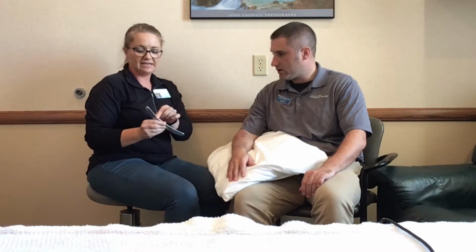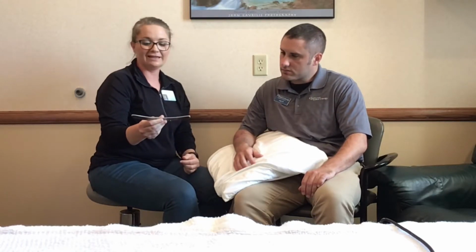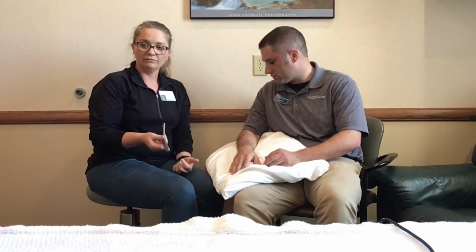And so you can see these edges are beveled. So it's not like I'm hurting them or cutting them. Some of them look like knives, but they're nice and smooth. So we're just rubbing that area to get it released.